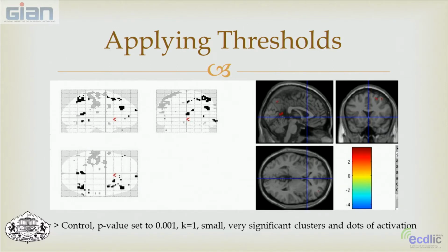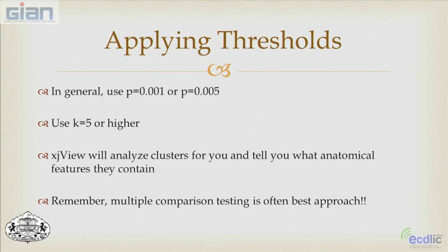Okay, so now what I've done is take the p-value at 0.001 and put our contiguous cluster size back to 1. So any voxel that exceeds 0.001 in p-value will be shown here. You don't see a lot of them here on the image just because of the location that I picked. But you can see in our glass brain, again, we're seeing a lot of spottiness. We're not seeing as much activation because of this higher p threshold.